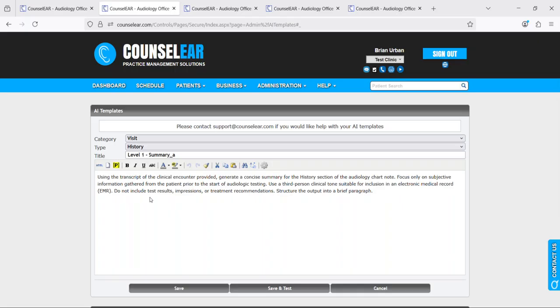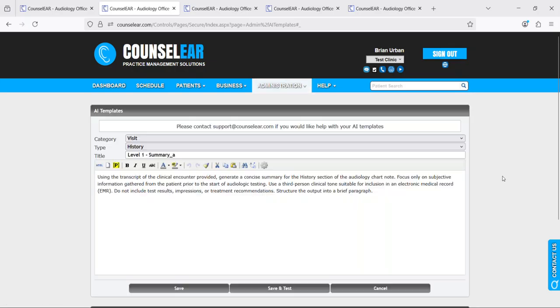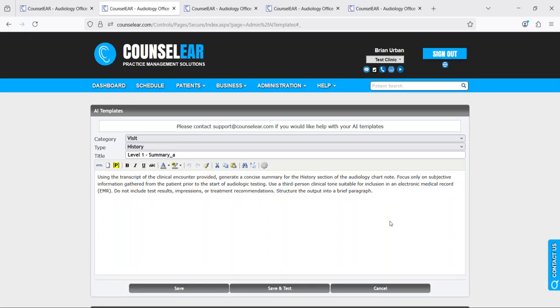Now it's important to note that the AI templates are not the same as your typical history, results, recommendations templates. Those are really just kind of simple text, whereas the AI templates are telling the AI system really how to take the transcript and turn it into text that you want. So it's very different. So you would not copy and paste, for example, templates that you already use that are in the history section into the AI template. That would not result in quality output there.